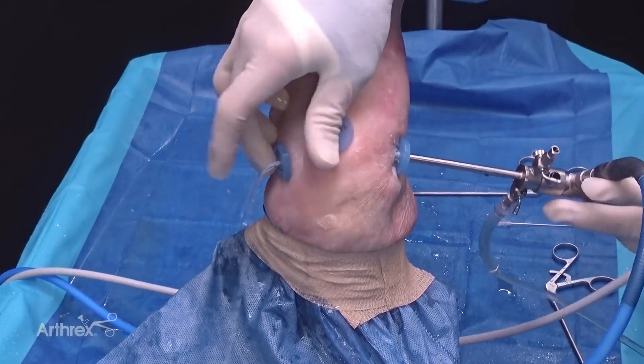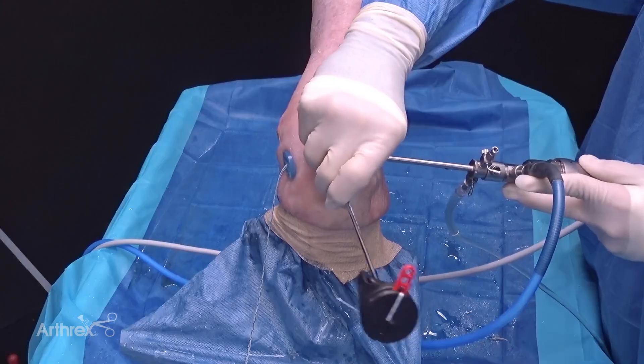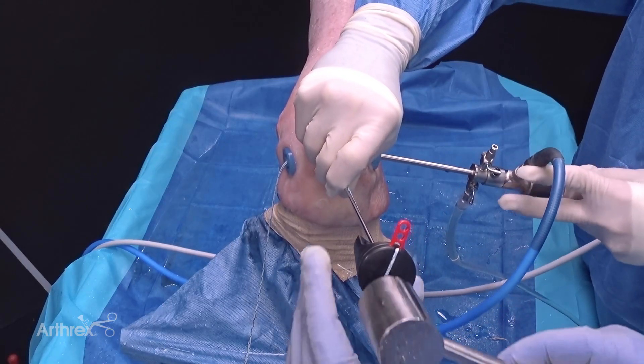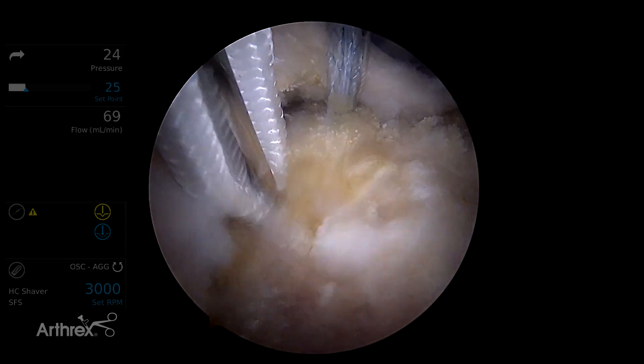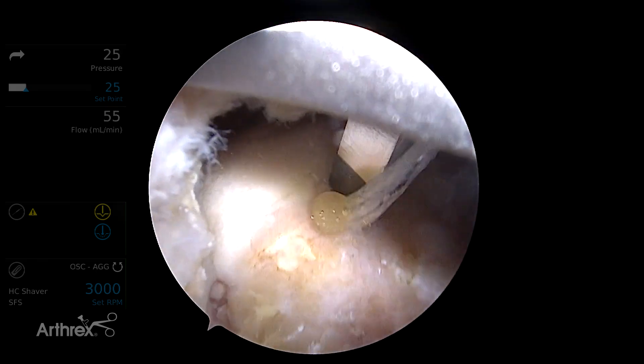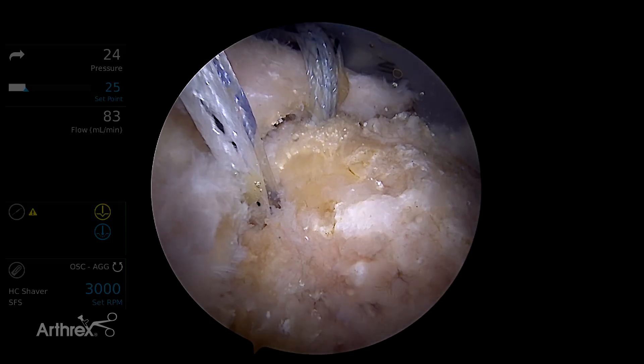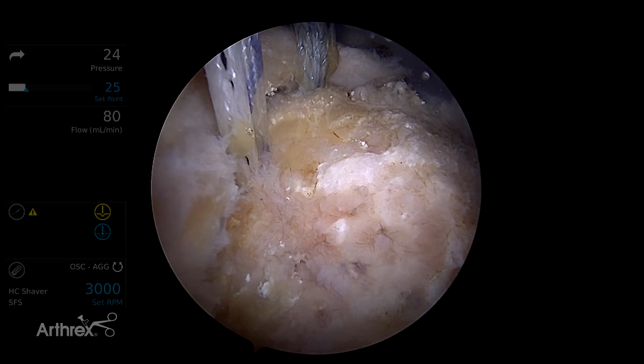Here's our anterior anchor placed adjacent to the articular margin through an ASL portal. Next we're going to place a middle anchor. We're going to use the self-punching aspect of this to save steps. You can see the depth is marked on the inserter to confirm appropriate depth of placement. We can also set the anchor by gently pulling the tapes to bring the sheath up against the bone.